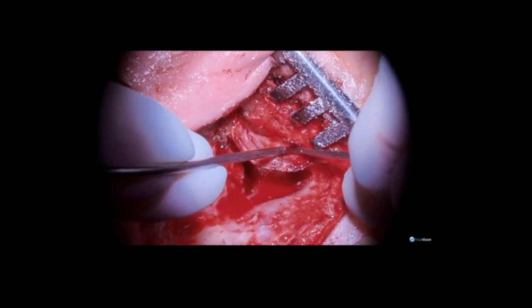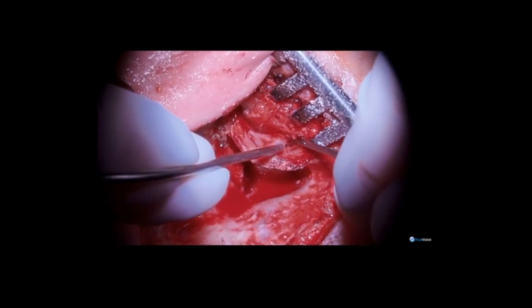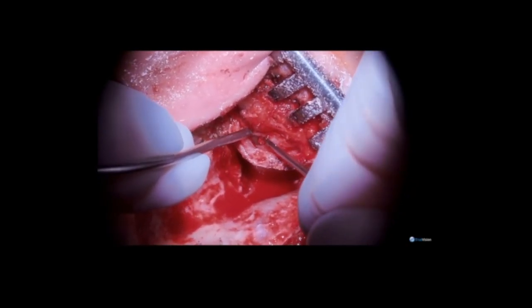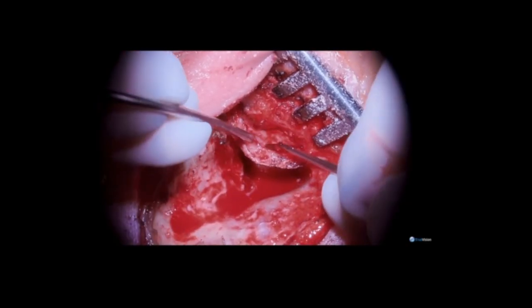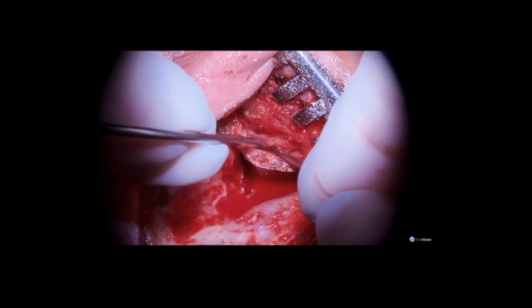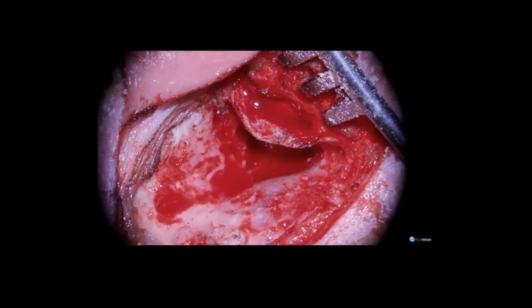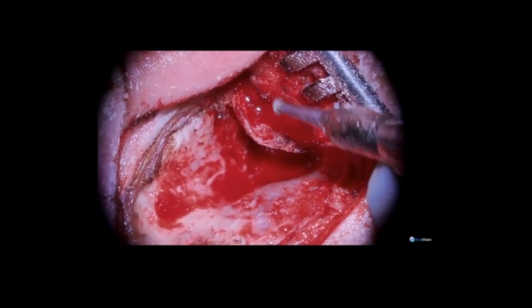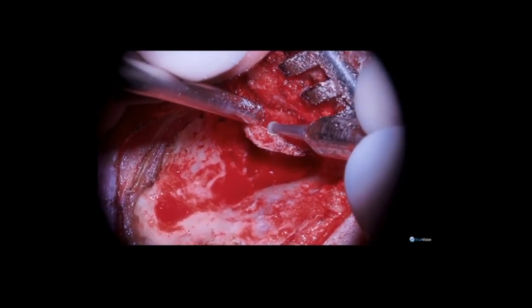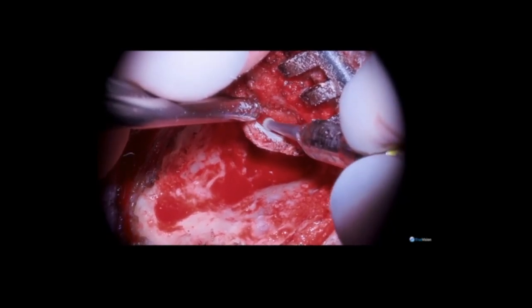I will now elevate the remainder of the external auditory canal skin and then make incisions to create a Koerner's style flap, and then move it forwards with a bladed retractor to get a good view of the attic region. I am smoothing down the spine of Henle in order to get an optimal view and working space transcanal.